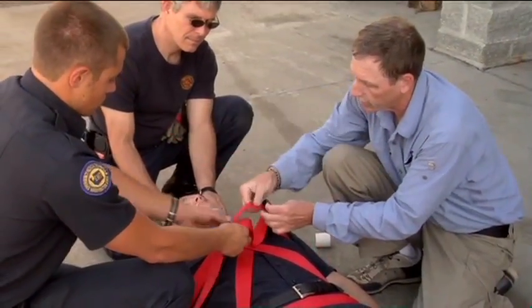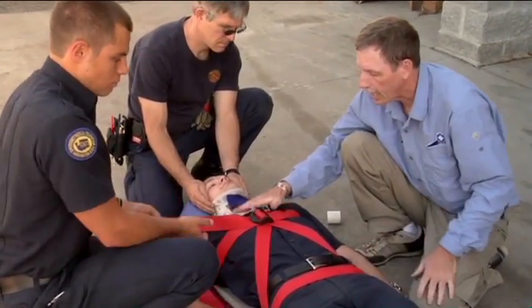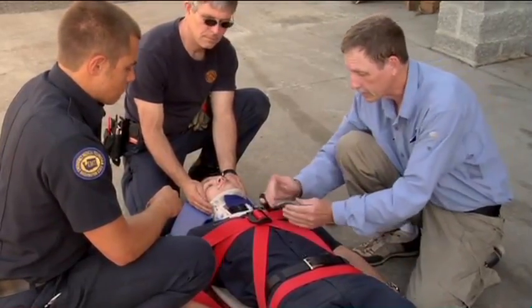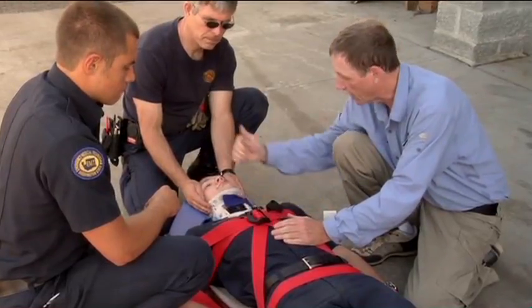And we're going to go ahead and just snug this up. We're not going to tighten it all the way yet. But now we have the mass of the upper body should we have to move the patient in an emergency, or if the patient should vomit, we can at least keep the upper portion of this patient in line with the head.